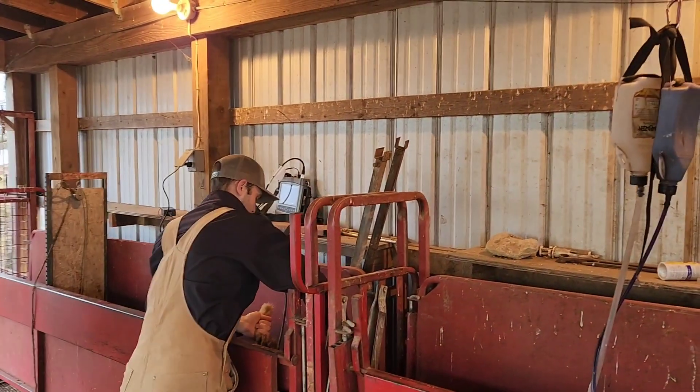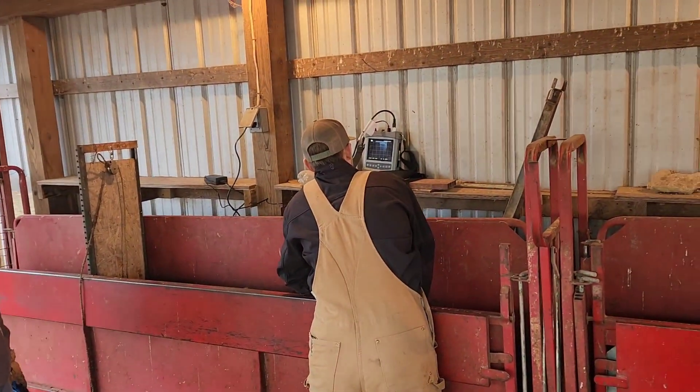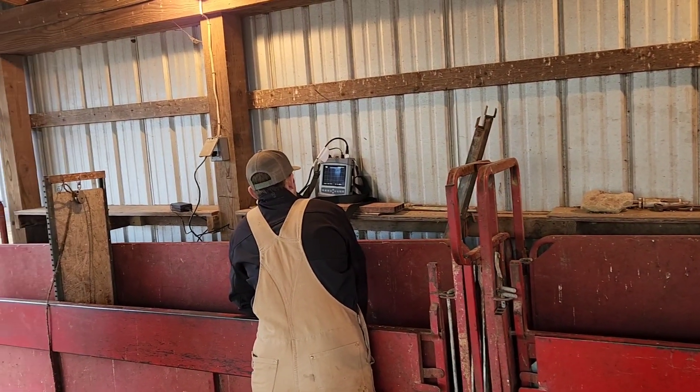We've got a few hundred to do, and we can see if they're bred or open, separate them accordingly, and feed them accordingly.